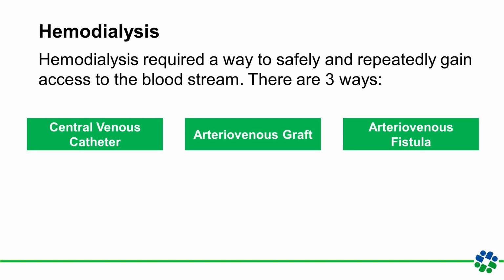So in choosing the most appropriate access method, we prioritize your overall health, your dialysis efficiency, your lifestyle considerations, and ensure that the process is as effective and comfortable for you as possible. With that being said, there is some exciting technology coming to the forefront that will help patients and clinicians communicate and manage your care more effectively about the status and function of their access.